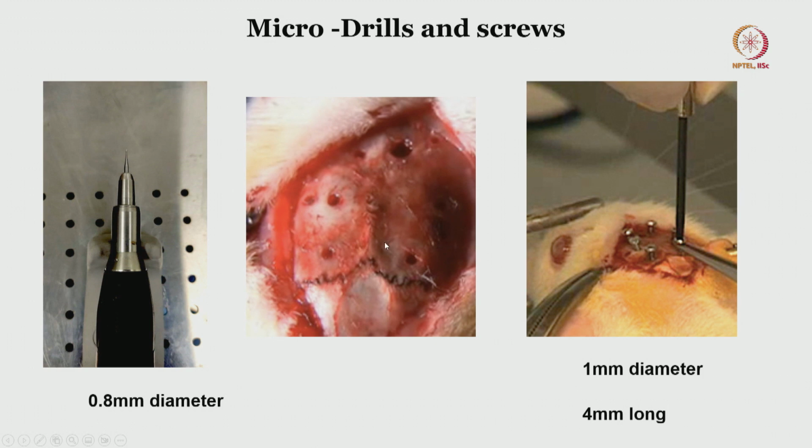It's very important to practice this particular step, because these are important both for craniotomy as well as for stereotactic surgeries. These are the holes for the anchoring screws. If you wonder why these screws are used, they are used in order to anchor the equipment or the interface device that is going to come on top of the skull of the rat, be it a drug delivery cannula.